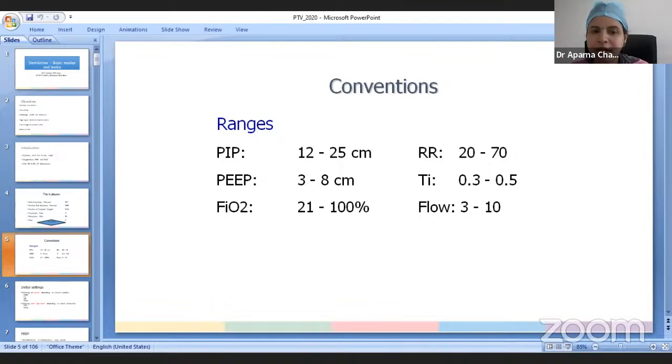Setting respiratory rate depends upon the baby's work of breathing and the presence or absence of asynchrony. If the baby is having significantly increased work of breathing, like a baby who is already breathing fast with hyaline membrane disease, increased work of breathing, reduced functional residual capacity, the baby is having recessions and some asynchrony, it is better that we give the baby a relatively higher respiratory rate. Typically in preterm RDS, we may want to start with a rate of 55 or 60 breaths per minute.